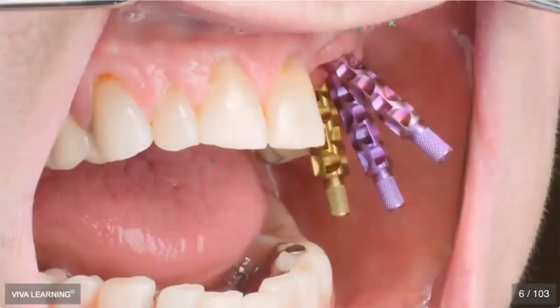And here you go. I don't even need to talk about this one. Look at the impression copings on this case. How do we manage cases like this? How do they happen in the first place? Hopefully today I'll talk to you about strategies to obviously avoid extreme cases like this. But it's just unacceptable at this point, given the technology and some of the solutions we have access to.